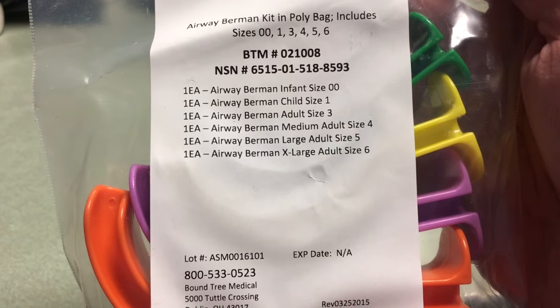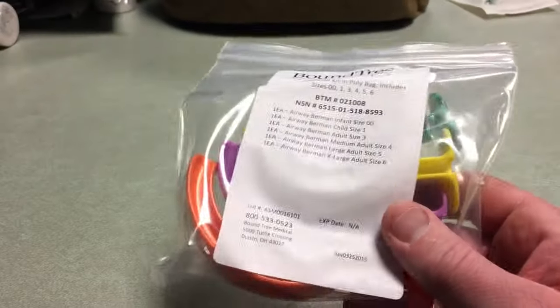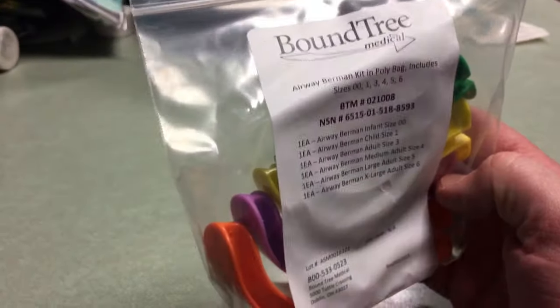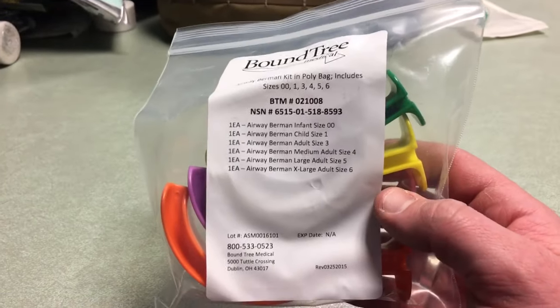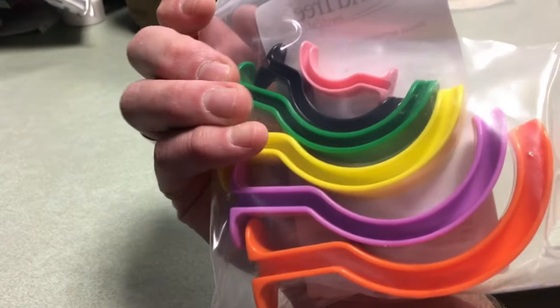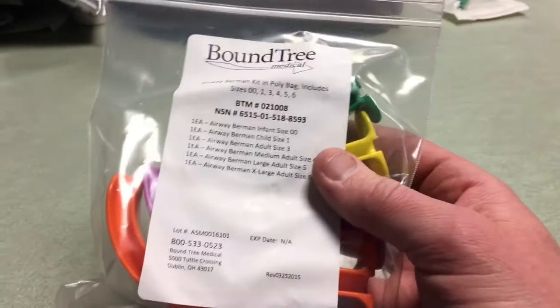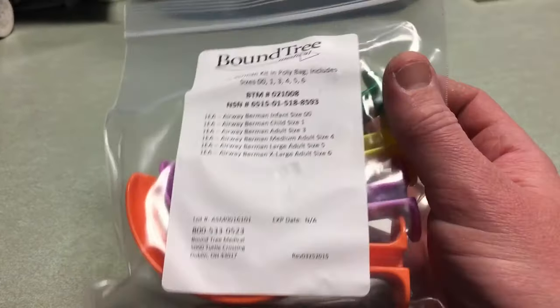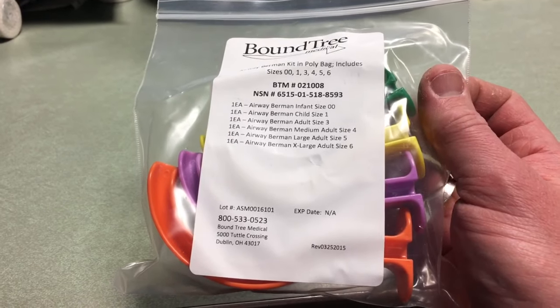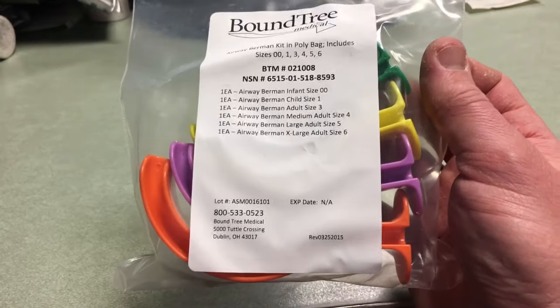Last up here we have an airway Guedel kit — my understanding is it's a similar concept, a way to open up an airway for someone who's unconscious or not getting airflow properly. The cool thing is it comes in different sizes: infant, child, adult medium, large, and extra large, color-coded. I've never used these and won't pretend I have, but they could certainly be helpful in an intense situation. It would have been helpful if they labeled the colors on the packaging — that's something I'll write in so I know which size to grab.